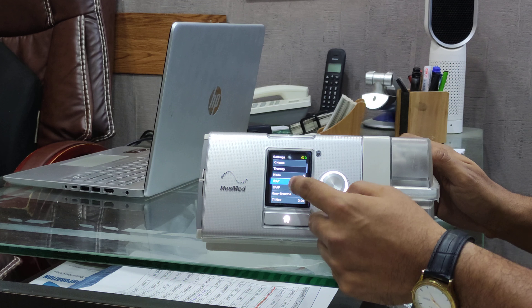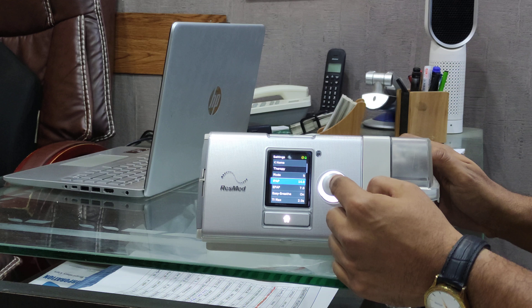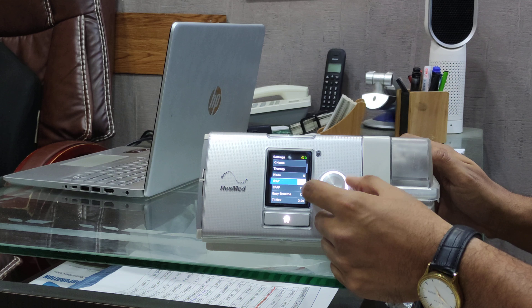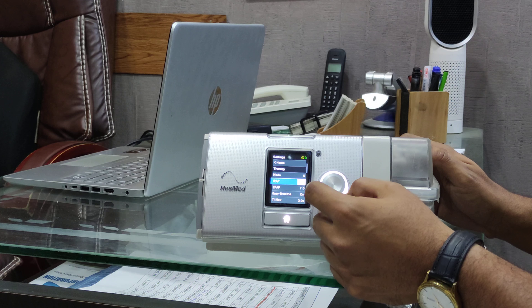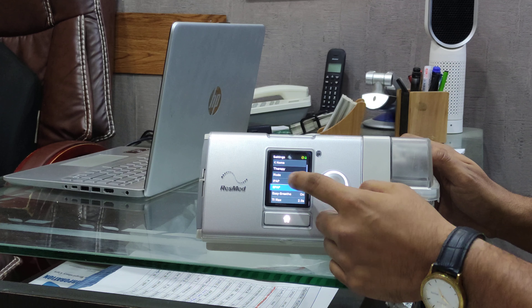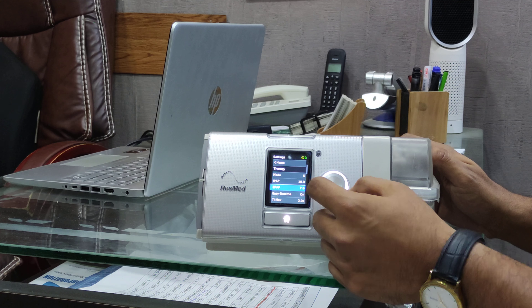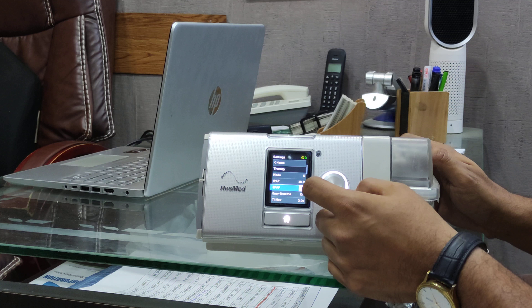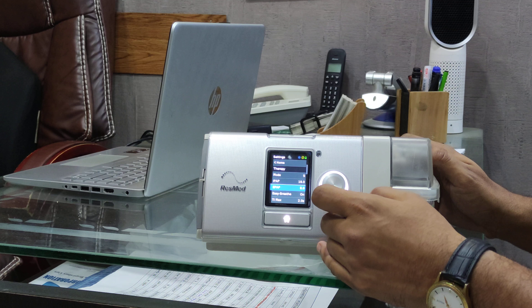To set the IPAP, click this button and use the regulator clockwise. Once you enter the setting, move the cursor to EPAP, press the button to make it 8, and then press it again to lock.